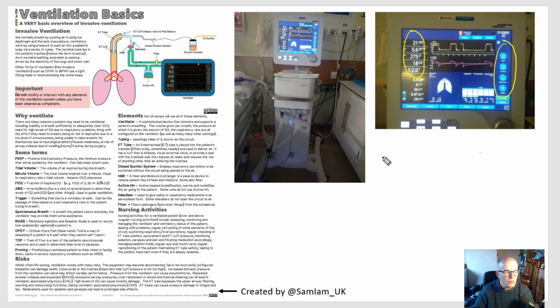I'm not going to go too much into modes because this is just going to be the basics, and it's not something you're going to be expected to set and reset if you're not experienced in ITU. But that mode is dictated by these letters up here, and this one is PSIMV, and that's one that is quite common as well.